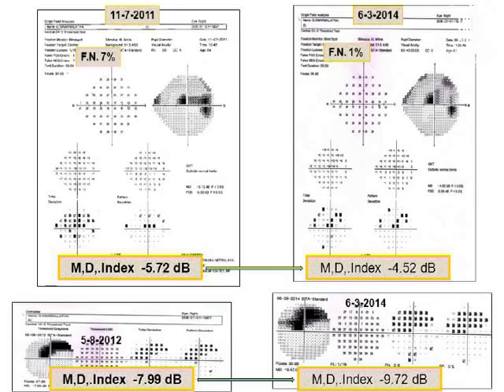But if you see 10-2 in this patient, the mean deviation of 7 became almost minus 10. 8 became almost 10. There is a change of 2 dB. In a localized scotoma, 2 dB means it is huge. And if you see the progression, it is almost coming into the fixation. So actually the progression is occurring in the 10-2 area. And if you see only 24-2, there is no progression.